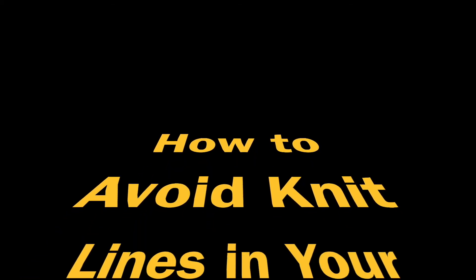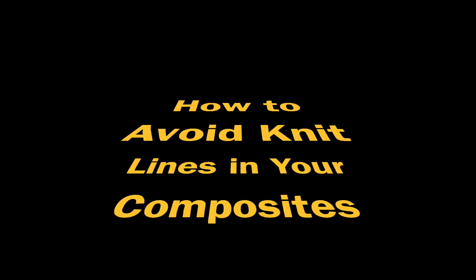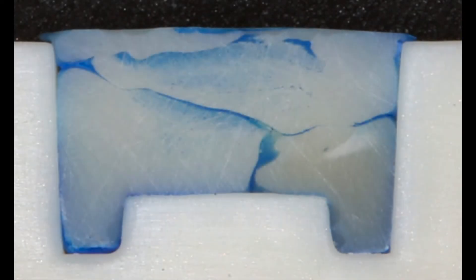Hello, this is Richard Price talking about how to avoid knit lines in your composite resin restorations. Here we can see an MOD restoration. Between each layer of composite there is a knit line where the two composites join. The question is: how do we get rid of these knit lines?